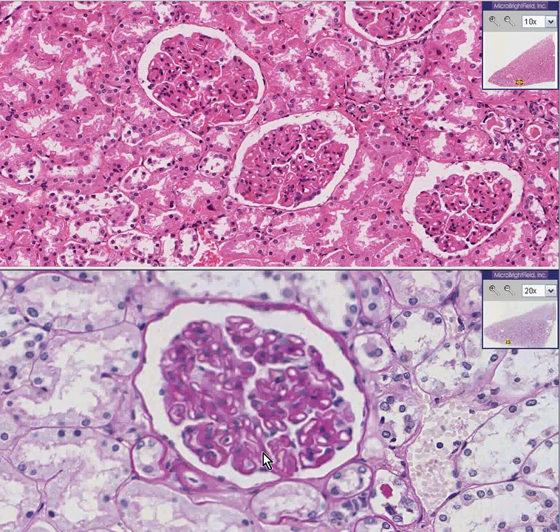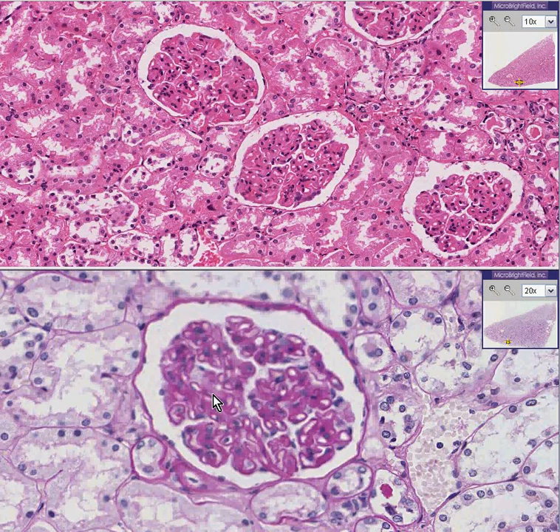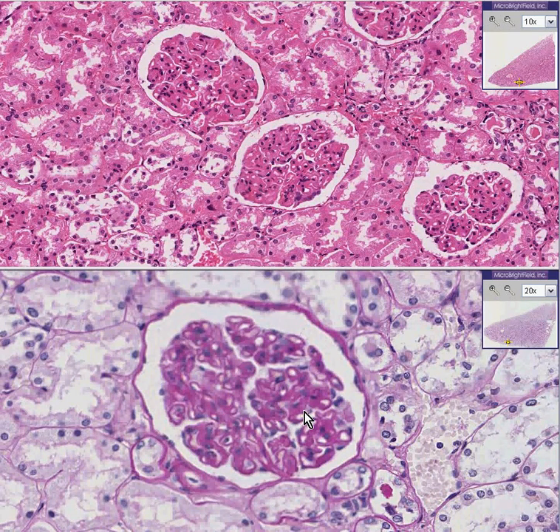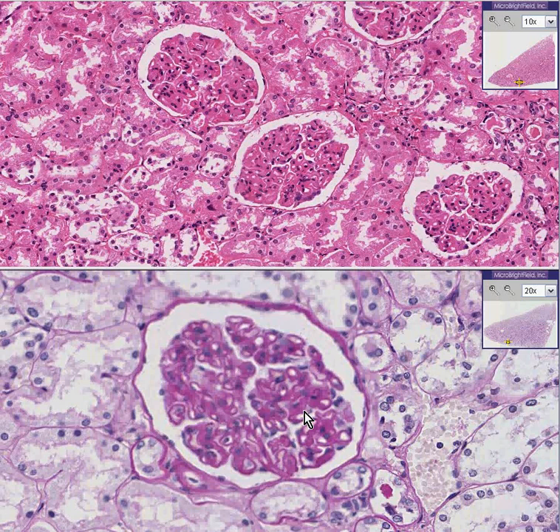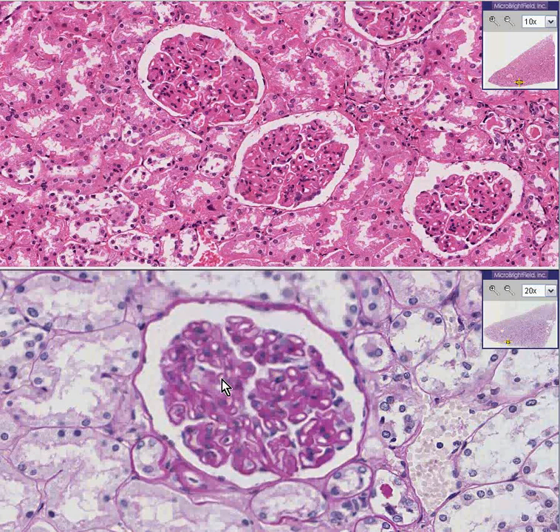in this disease, you can see deposits of immune material in the basement membrane, which causes the basement membranes to appear quite thick. And if you were lucky enough to have access to electron microscopy, you will notice that the thickenings in the basement membrane are somewhat spiked. You cannot appreciate that just from this PAS stain, however.